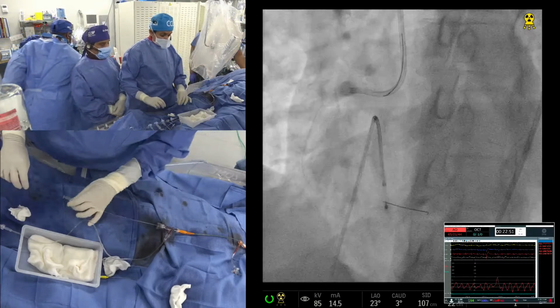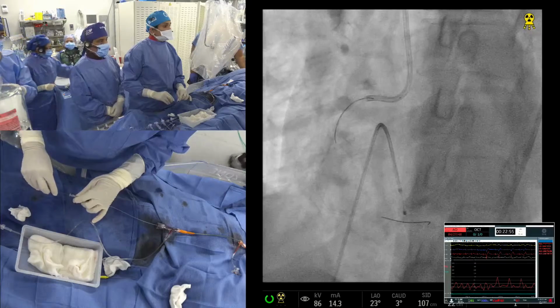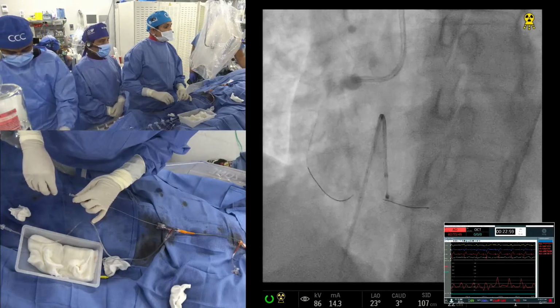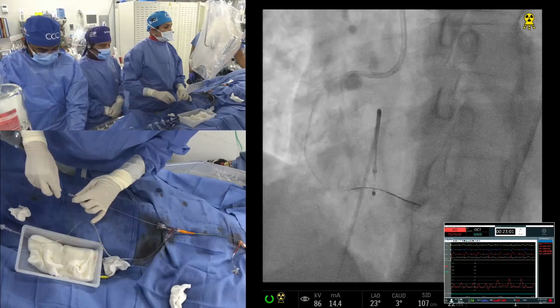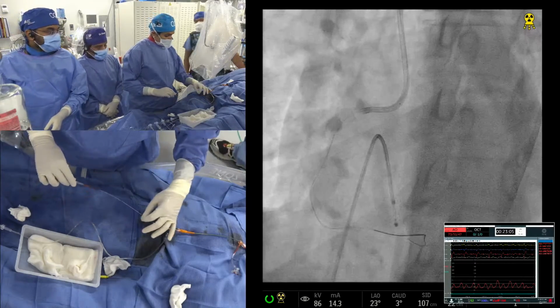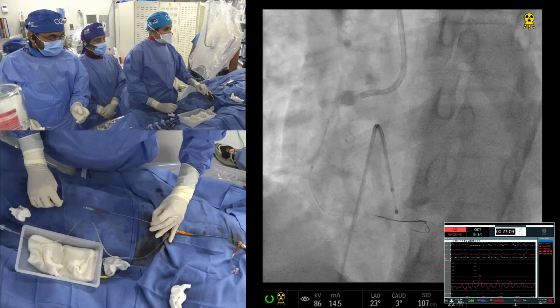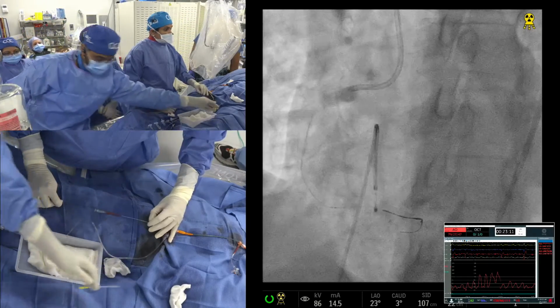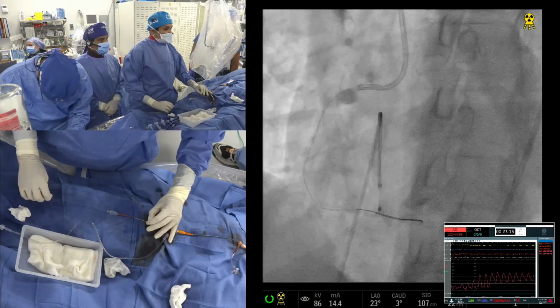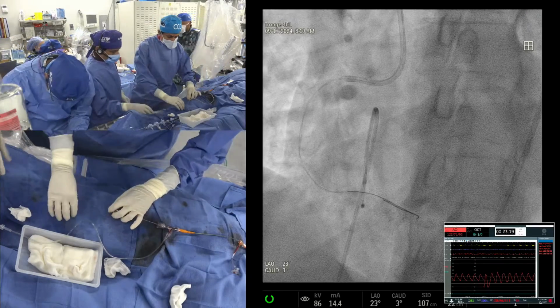So the whole question is, since the complexity is there and it's angiographically an intermediate lesion, can that be just controlled on maximum medical therapy? Absolutely, that's where the dichotomy occurs: if it's FFR positive, then we know medicine alone is not going to work. So that's where the decision will come. But anyway, let's do the proximal. Let's concentrate on the proximal, and then we'll see. Okay, now give me that, then we'll go with the rotor wire. We can take the other wire out, yeah.